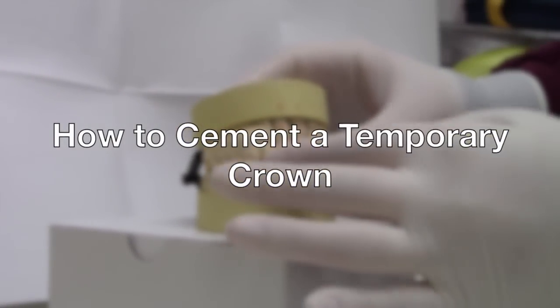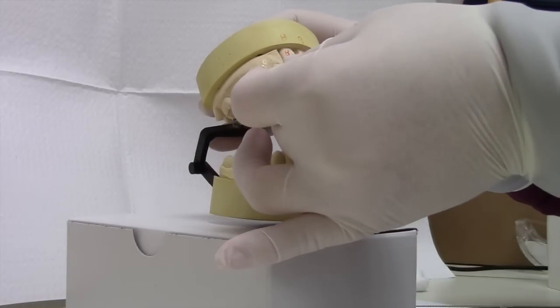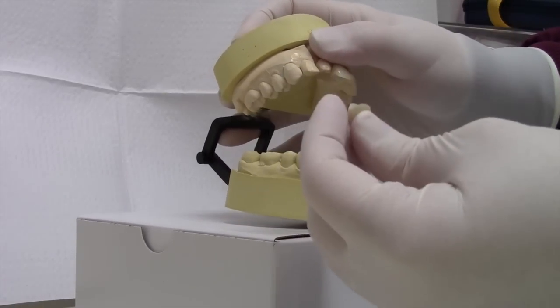As temporary crowns should not come off, sometimes they do. Cementing them is easy — just follow these simple steps.